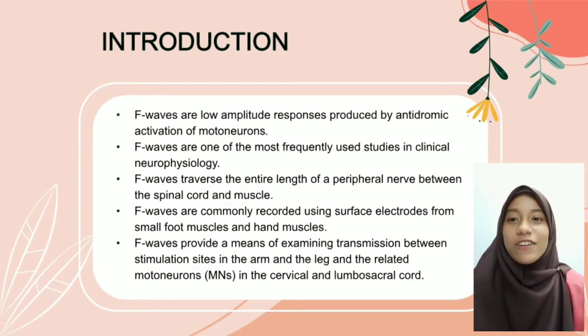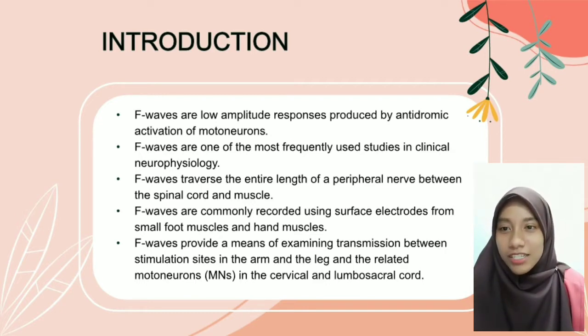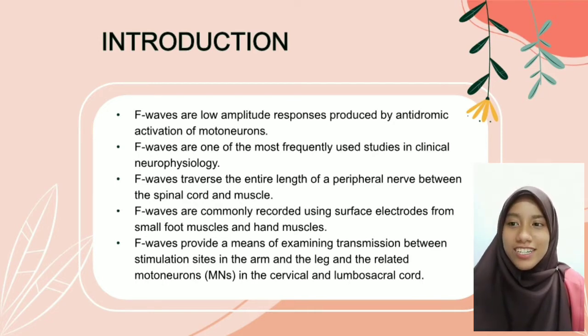an understanding of the physiology. The second one is F waves are one of the most frequently used studies in clinical neurophysiology. And much of the controversy surrounding the use of F waves relates to a failure to adequately consider the requirements of F wave analysis.